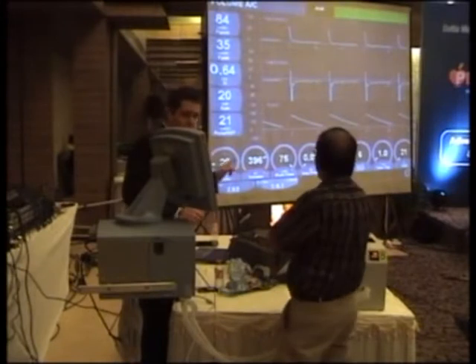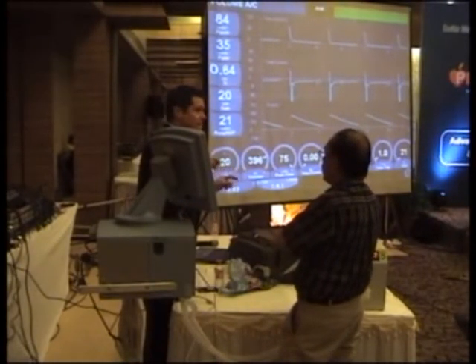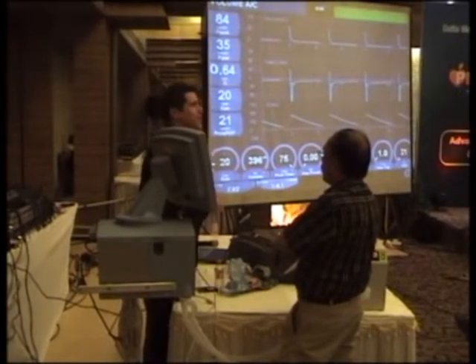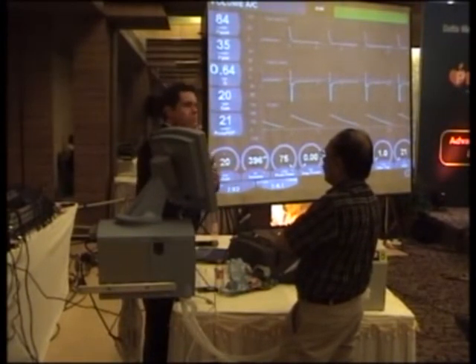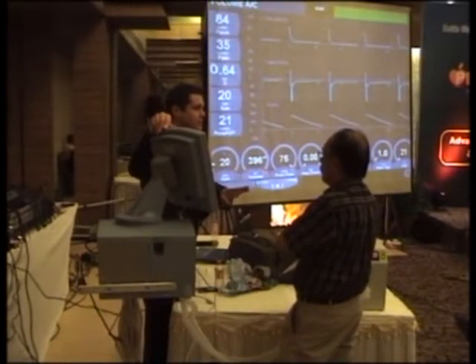So we've actually dropped our respiratory rate, and surprisingly, the blood gas comes back and the CO2 is lower. That doesn't make any sense. We dropped the rate. Okay. Well, this is one of those complex patients where you drop the respiratory rate and the ventilation improves because you're allowing more time for exhalation to occur.